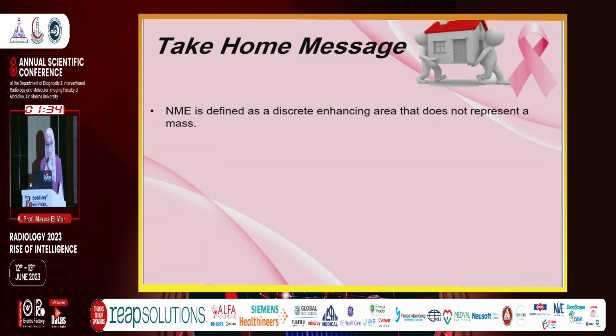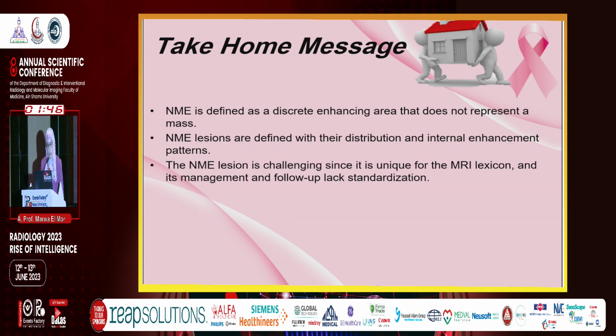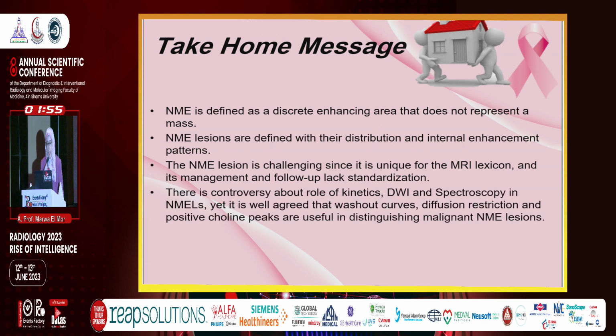So the take-home message: non-mass enhancement is defined as a discrete enhancing area that doesn't represent a mass. Non-mass enhancing lesions are defined by their distribution and internal enhancement pattern. They are challenging since they are unique to the MRI lexicon, and their management and follow-up lack standardization. There is controversy about the role of kinetics, diffusion-weighted imaging, and spectroscopy in non-mass enhancing lesions.